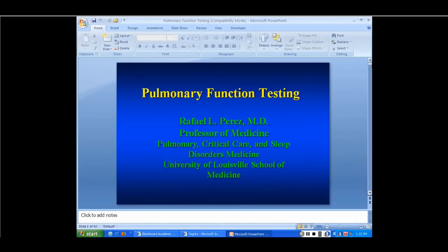Yeah. On clinic patients with standard COPD, do you recommend getting DLCO, or would spirometry alone be sufficient? No, I recommend getting the DLCO, at least on the initial workup, because it does tell you about how gases are transferring. If they're very hyperinflated, does it correct up? Is that more consistent with hyperinflation? And again, as I said, if their DLCO is less than 50% predicted, I'm going to check them out to see if they need supplemental oxygen, either ambulatory or continuous oxygen. So it does help dictate the steps I will be taking afterwards. So it's always good to have a baseline DLCO.